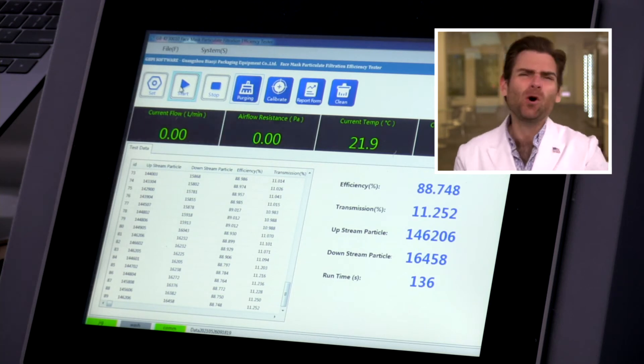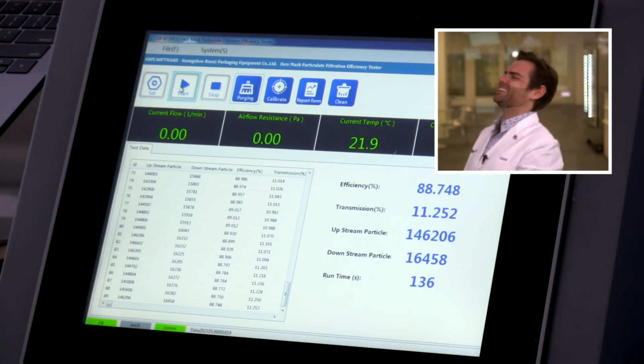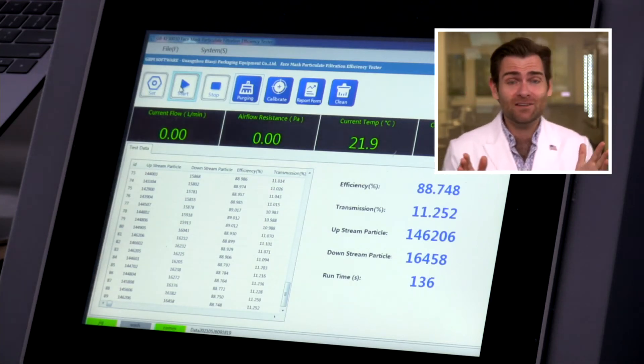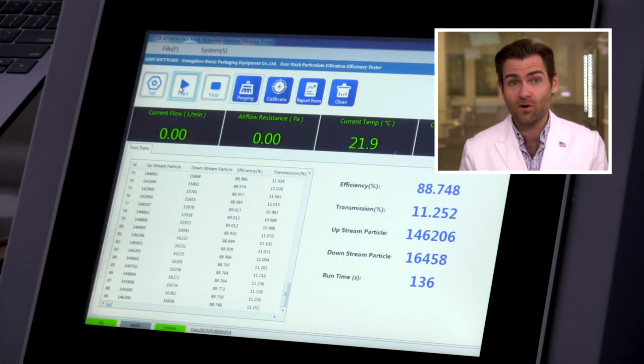Good mask — pretty good construction. But does any of that matter if it doesn't protect you? That's what this machine is meant to test. I have no idea what's coming — we're finding out together. The minimum standard in the United States is 95. This came in at 88.748. Now remember, if you were going to actually test these in a lab you'd test 5, 10, or 20 masks and average them, but I don't think that average is going to come up to 95 if it's that low.